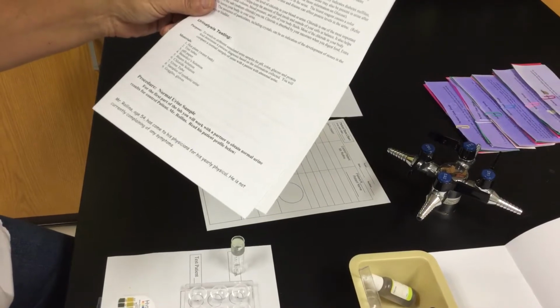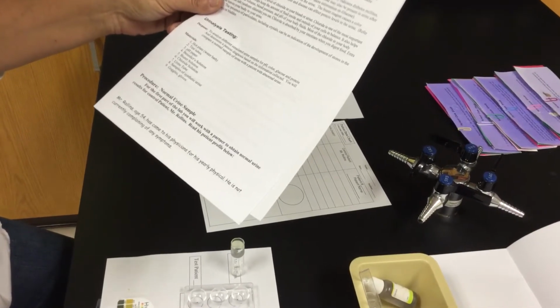So Mr. Rollins is age 54. He's come to the physician for his yearly physical, his yearly checkup. Along with blood, they usually will test urine. So he's not currently complaining of any symptoms. Because of his age, urine's one of the easiest things for them to go through and collect.